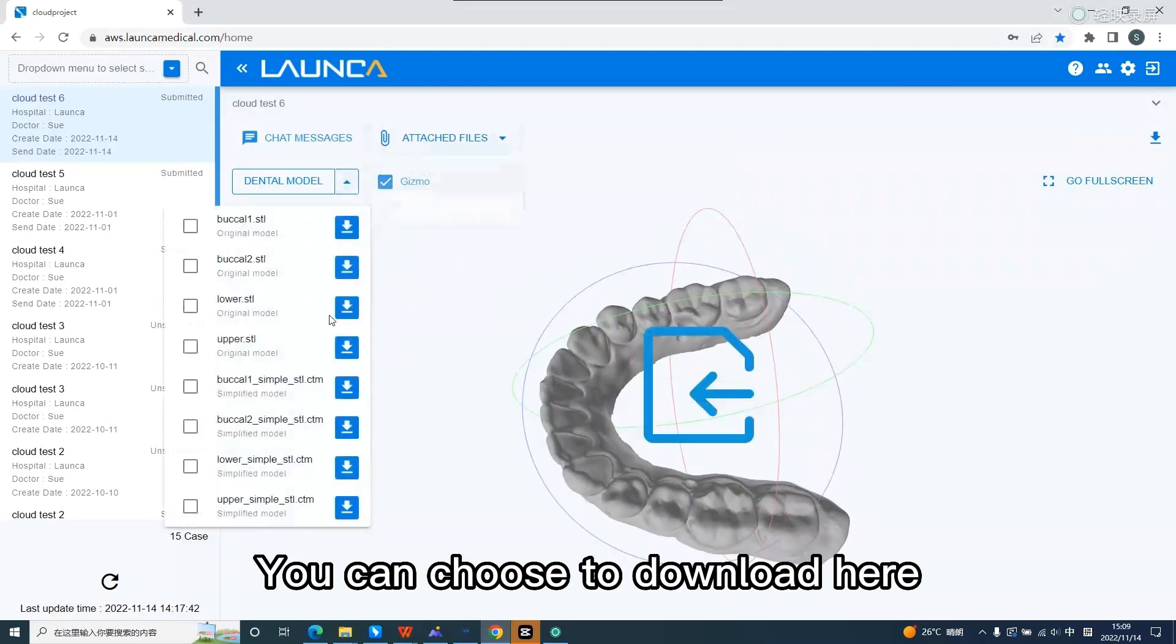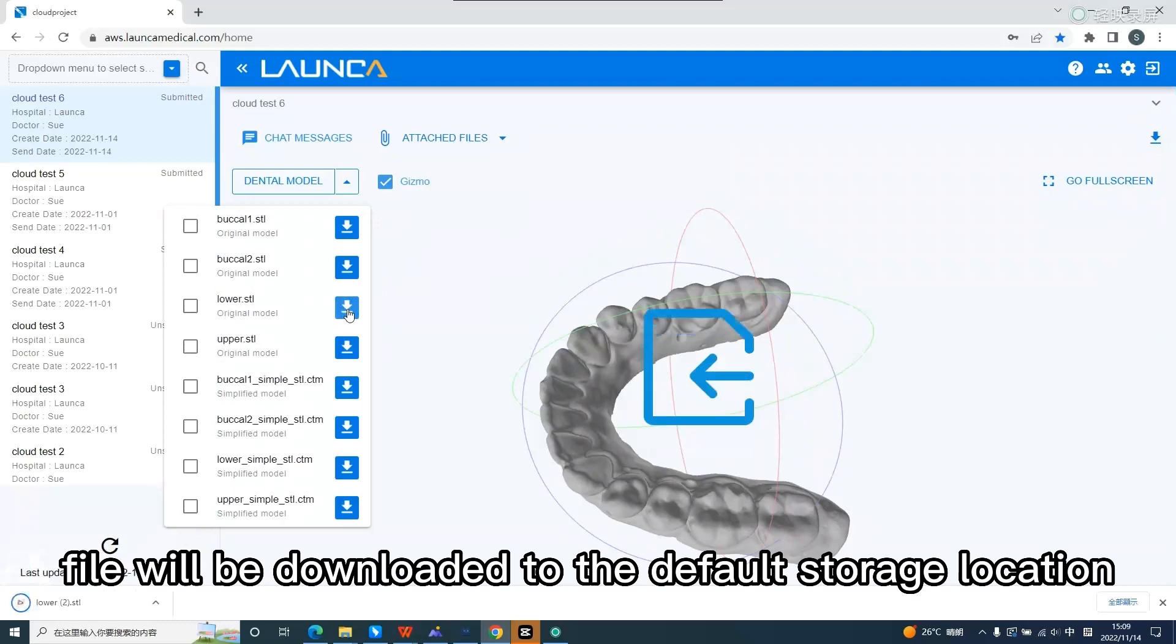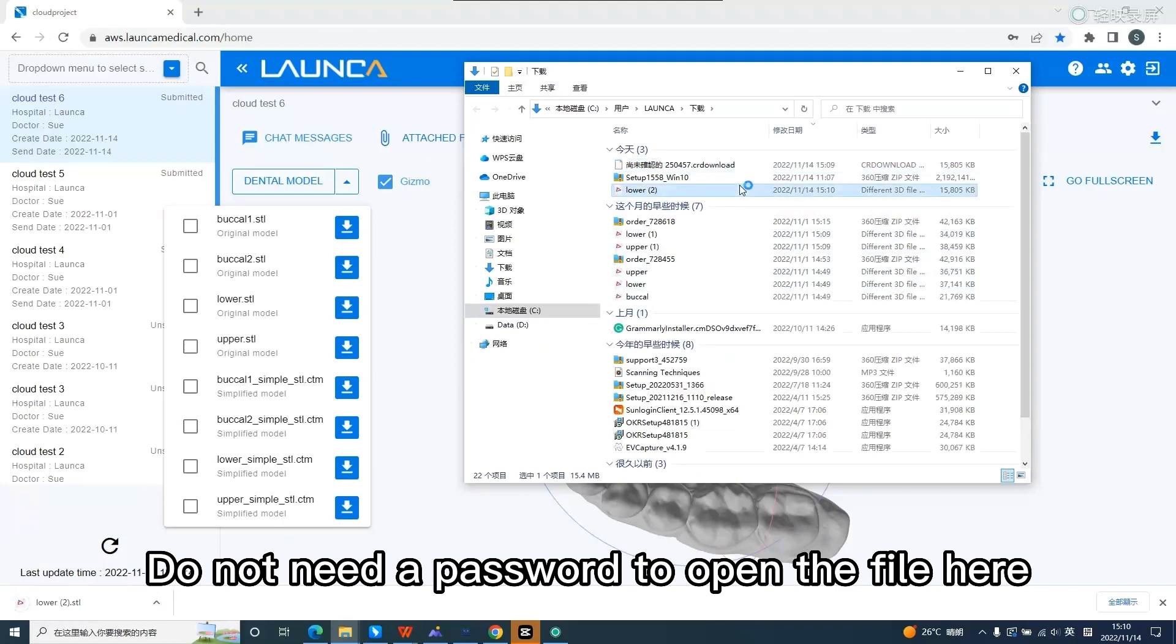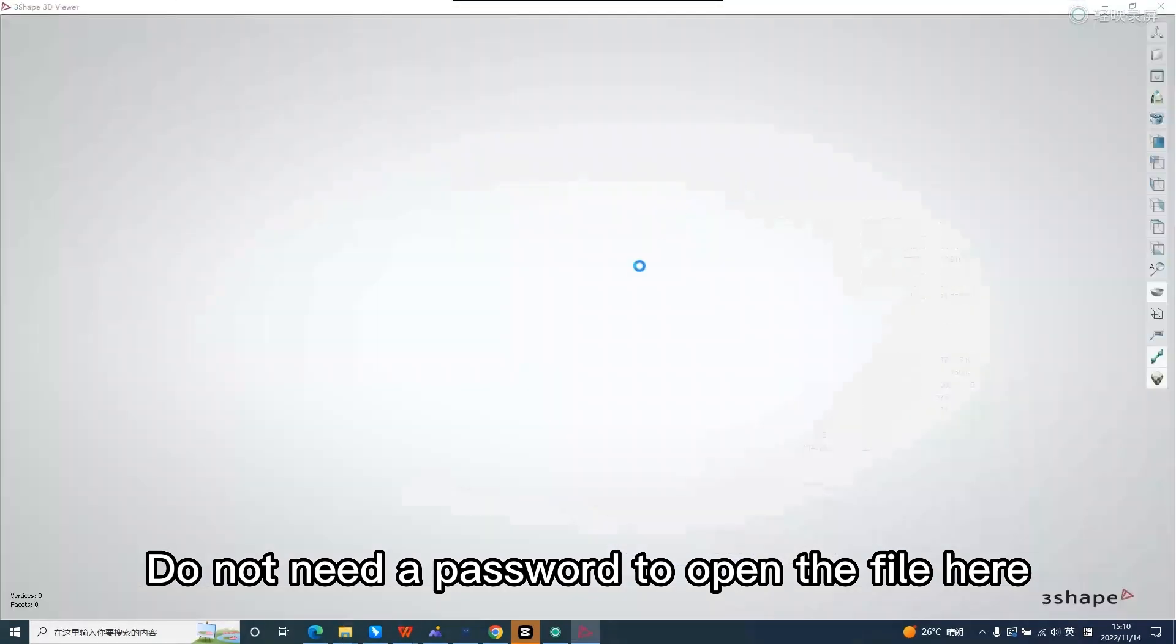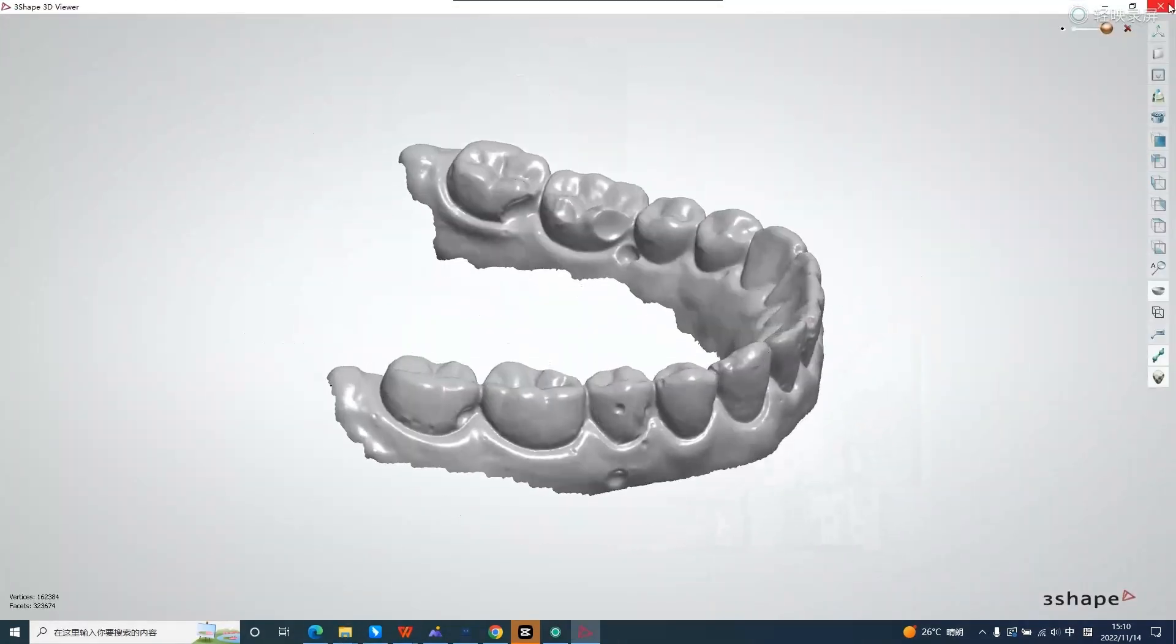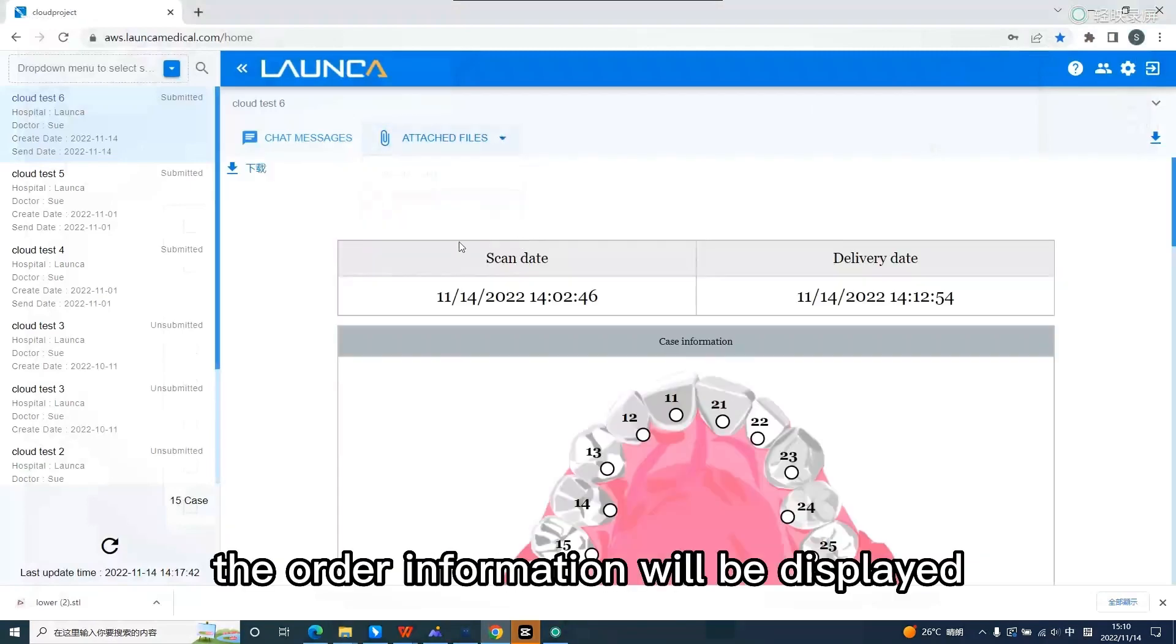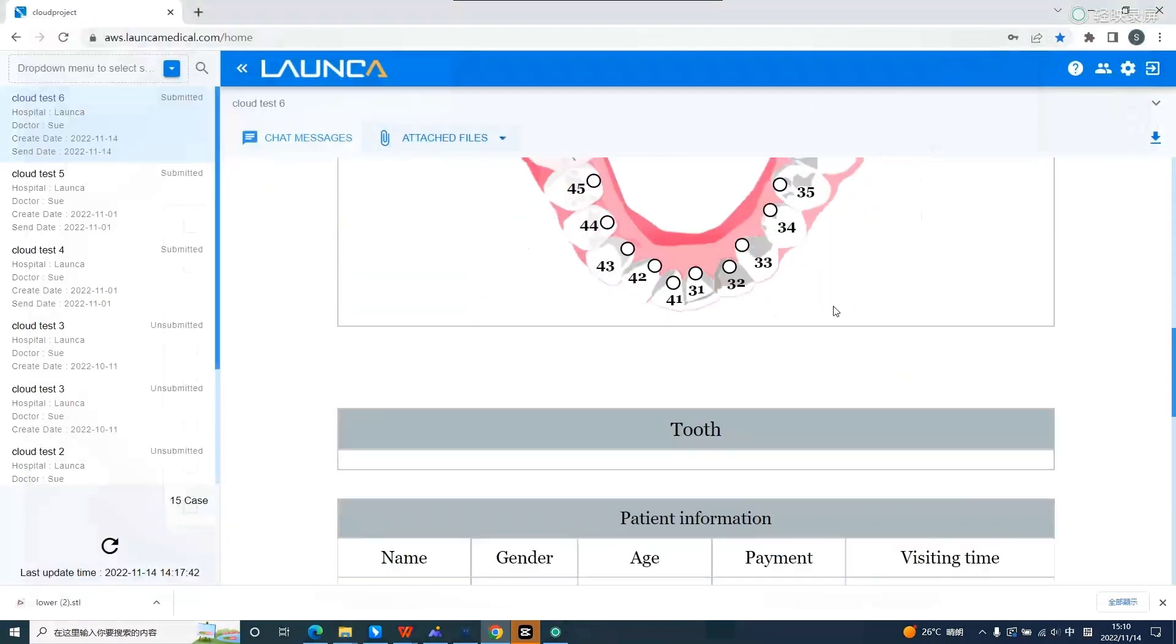You can choose to download here. File will be downloaded to the default storage location. You can download them one by one or at the same time. Do not need a password to open the file here. Click on the PDF. The order information will be displayed. You can check it here.